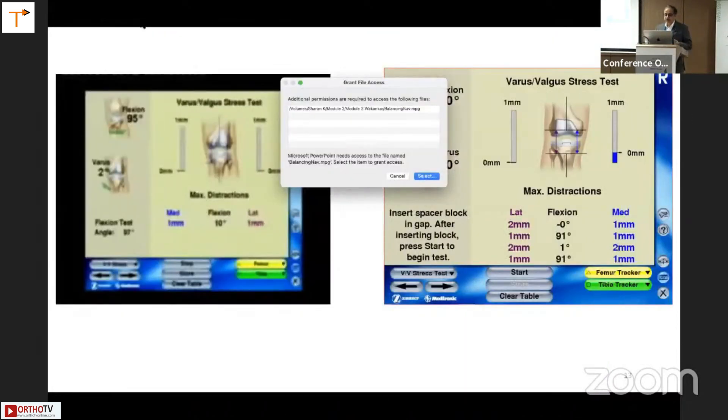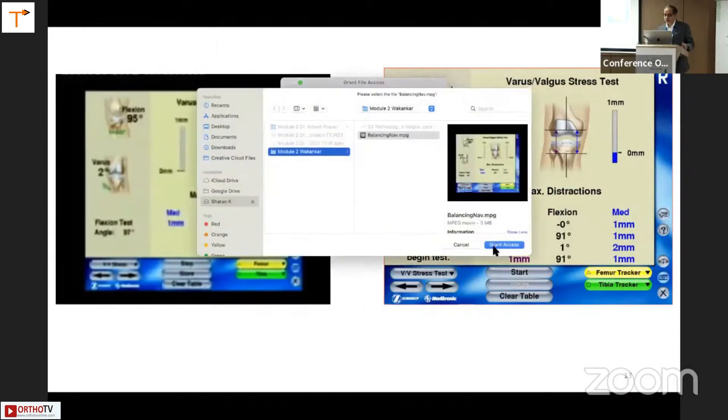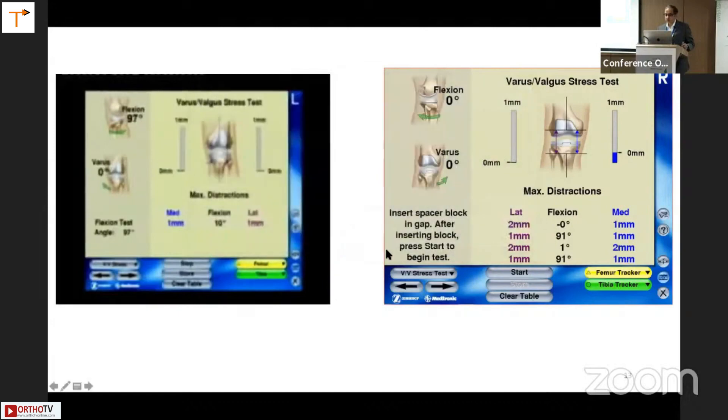On the screen for medial-lateral balancing, this gives a dynamic picture at each degree of flexion. This is the final screen — stressing medially and laterally in varus and valgus — showing what kind of laxity I have. For example, at zero degrees it shows two millimeter laxity laterally and one millimeter medially. This open platform navigation gave all that information and was immensely useful when managing these deformities.